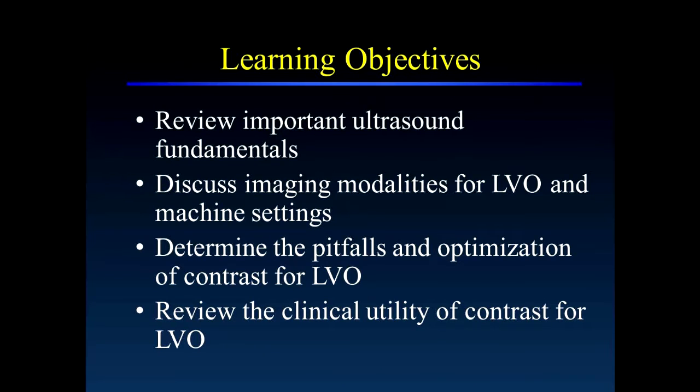The learning objectives for this presentation are to review important ultrasound fundamentals. We will discuss imaging modalities for left ventricular opacification and machine settings, determine the pitfalls and optimization of contrast for left ventricular opacification, and most of the presentation will, of course, deal with a review of the clinical utility of contrast for left ventricular opacification.